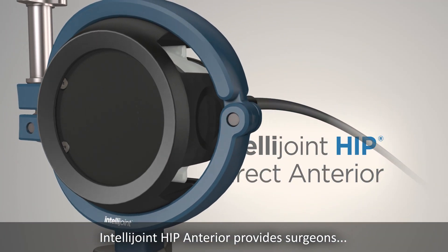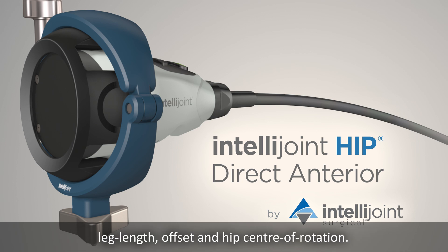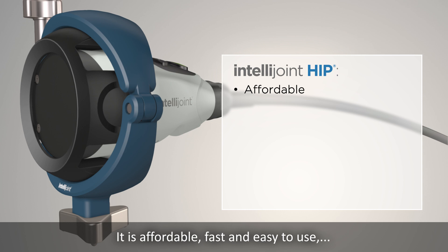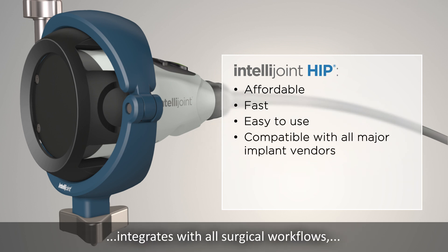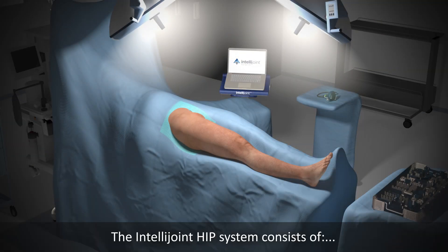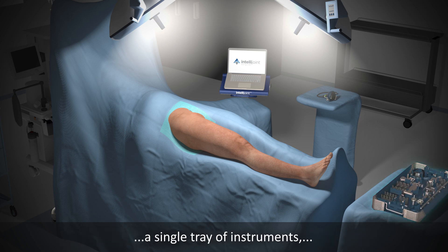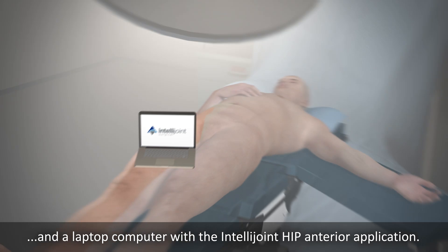IntelliJoint Hip Anterior provides surgeons with intraoperative measurements for cup position, leg length, offset, and hip center of rotation. It is affordable, fast and easy to use, and is compatible with all major implant vendors, integrates with all surgical workflows, and is suitable for both primary and revision hip replacements. The IntelliJoint Hip System consists of a miniature camera that resides inside the sterile field, a single tray of instruments, and a laptop computer with the IntelliJoint Hip Anterior application.